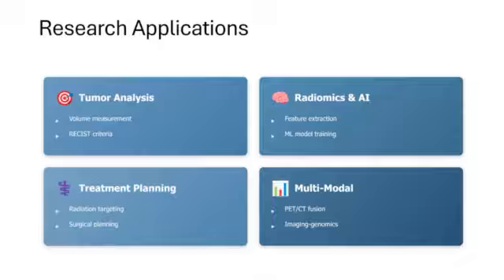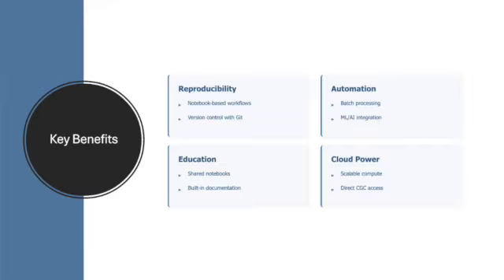So what are some of the key benefits? Rowan already mentioned this, but reproducibility is huge. Now remember, we're using Slicer Jupyter as opposed to the desktop version. And Slicer Jupyter adds the built-in aspect of the notebook. So you'll be able to take additional notes and run your code. You could potentially also do version control with GitHub.